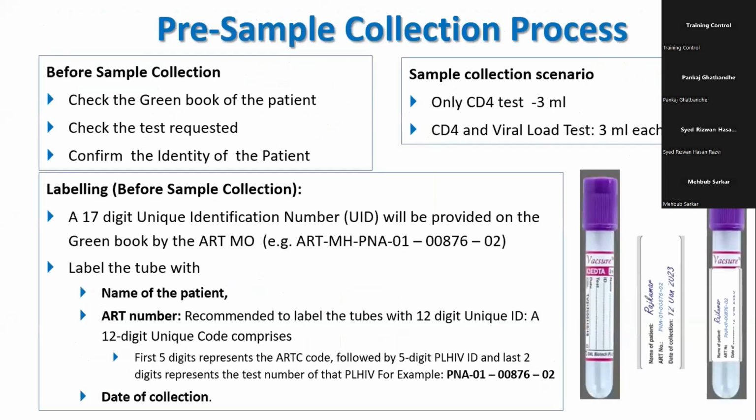Pre-sample collection process. As soon as the patient comes, actually, I wanted to make this an interactive session, but since there are so many participants, I will assume everyone knows this, but this is the practice. As soon as the patient comes, you are supposed to cross-verify their green book against the white card and check for whatever test has been requested, either a CD4 test or a viral load test.